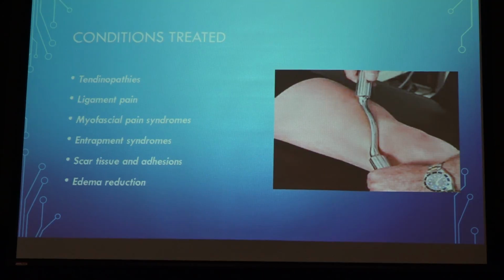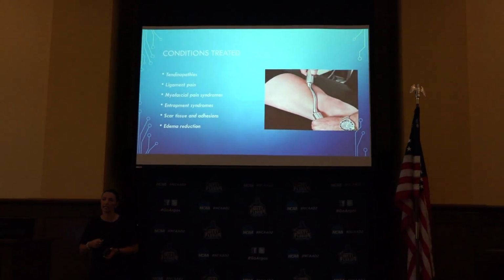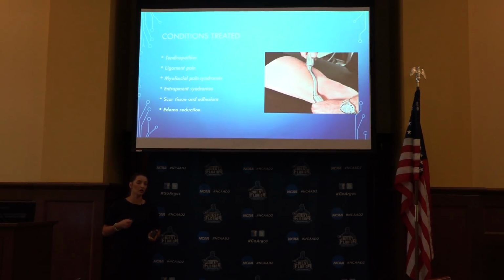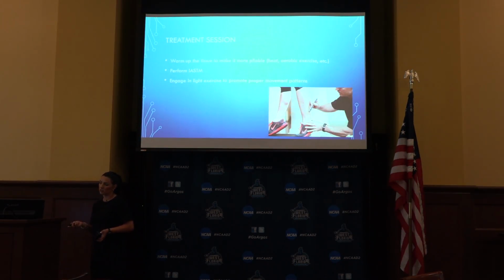Most of what I saw when I've been using this is tendinopathies. We use this in pitchers a lot. I saw volleyball players with patellofemoral stuff. That's most of what I saw. I didn't really see much else.